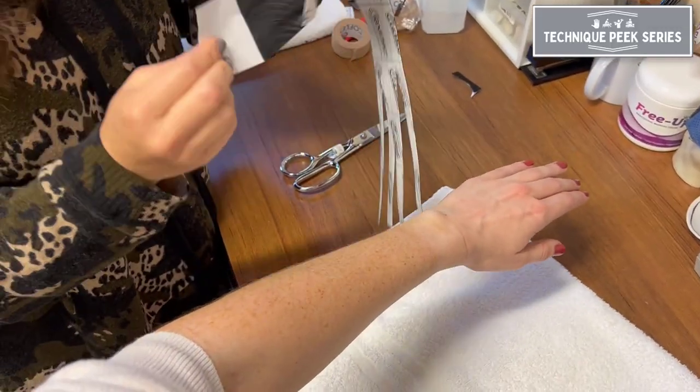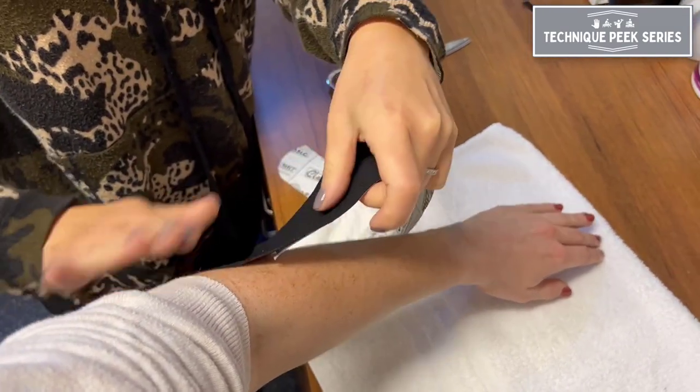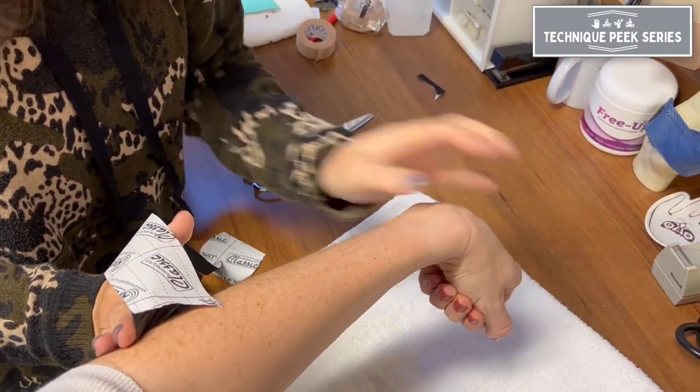To apply the tape, start with an anchor at the lateral epicondyle applying with no tension. Then you're going to place your wrist in flexion, slight radial deviation, and finger flexion.